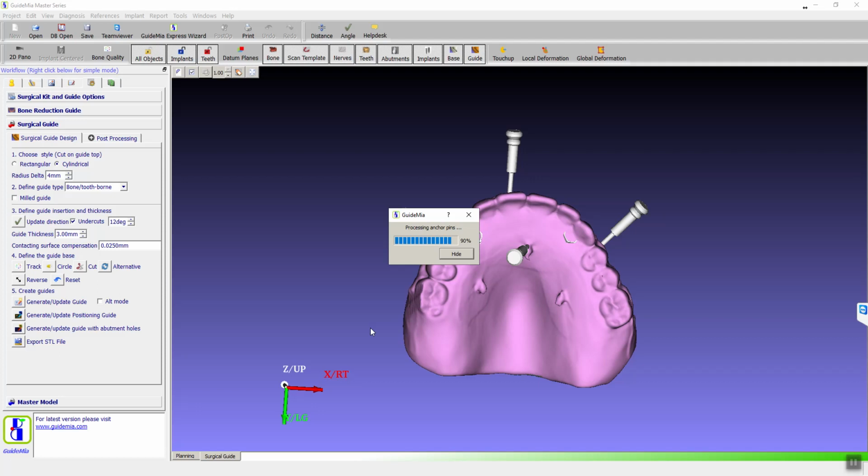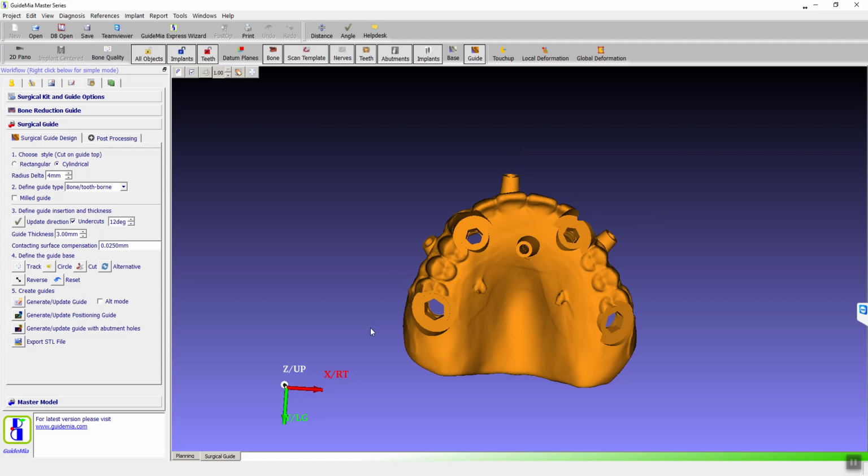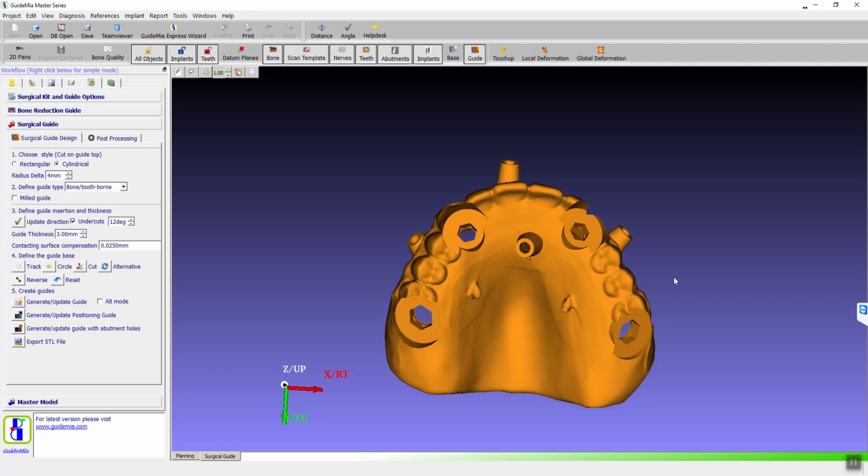Right now with this, you could use a standard bite registration, put that in the patient, have the bite, drill the 3 holes, and you're good to go. But now you could even do it here. Use this as the guide for the whole placement.